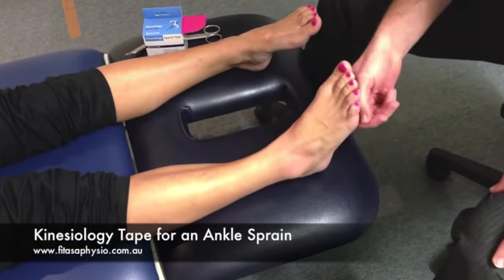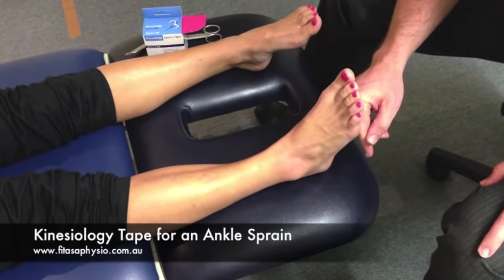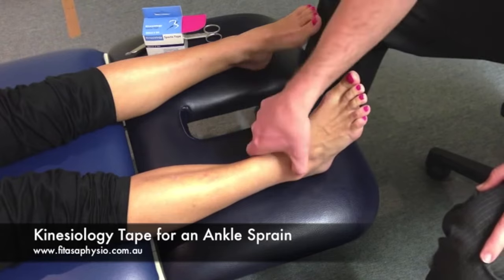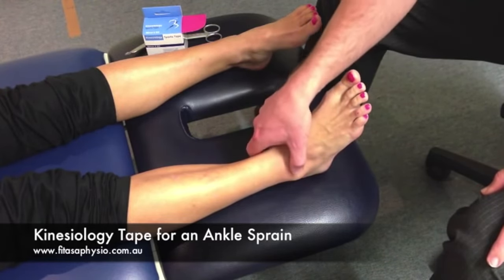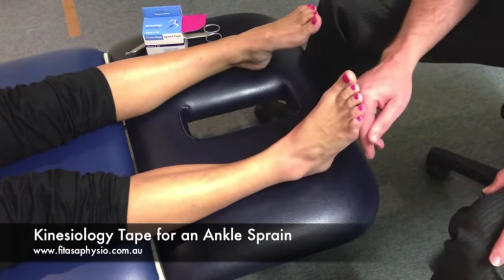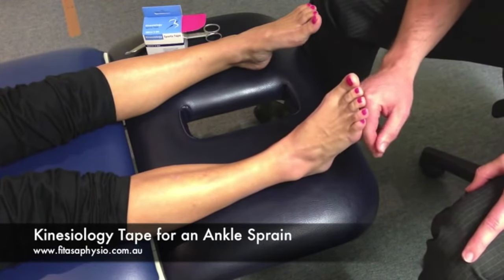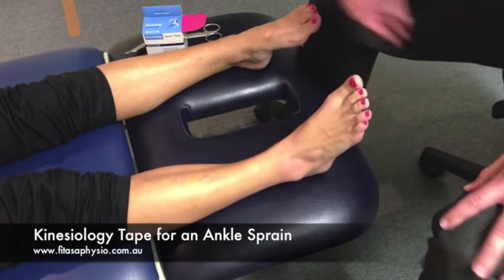This is Emma — she's had a nasty grade 3 lateral ligament ankle sprain a couple of months ago and she's just trying to come back and play netball. She's still pretty tender over her anterior talofibular ligament. I'm going to put some kinesio tape on it to give her some proprioception, balance support, and just a little bit of support and a feeling of balance through the ankle.